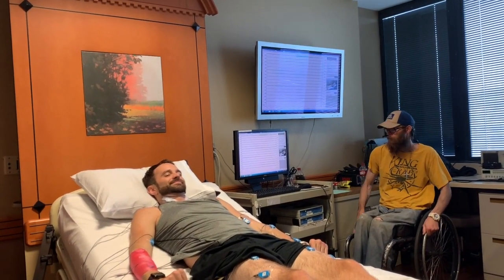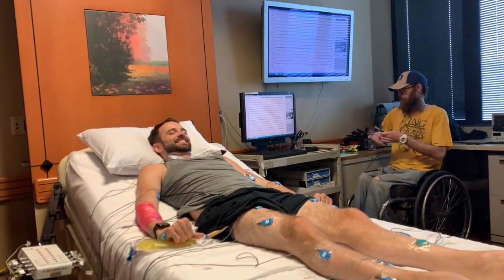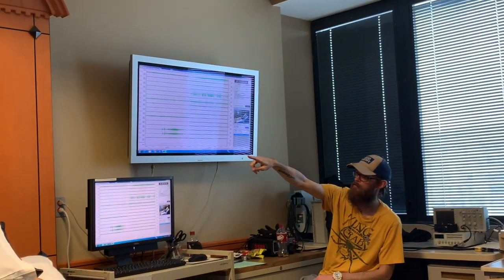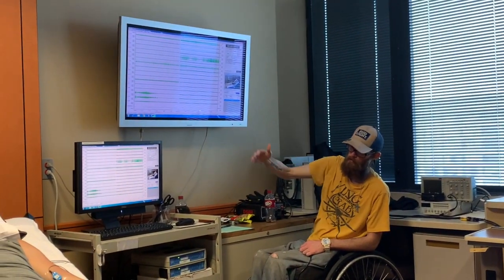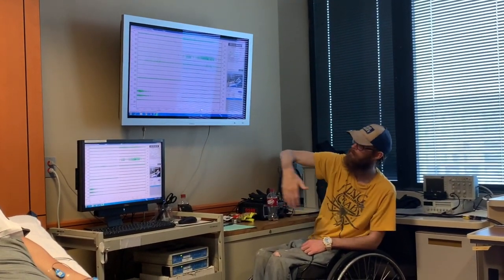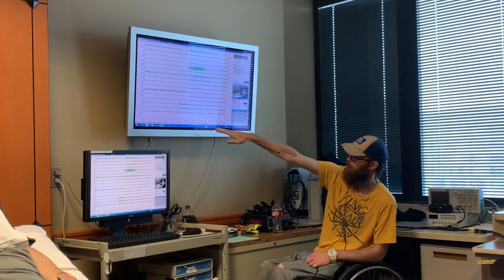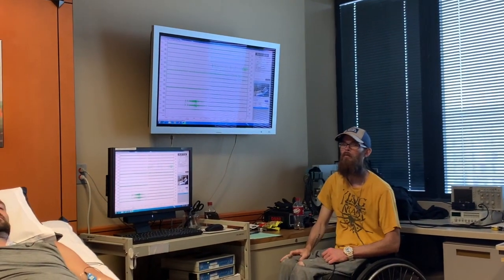Five minutes relaxation. You already know the drill. The screen shows that side of his body — his right side. It's labeled from top to bottom based on the electrodes that are on his body. The very first line is the one that's on his neck, and the very bottom line of activity is the one that's on his ankle.